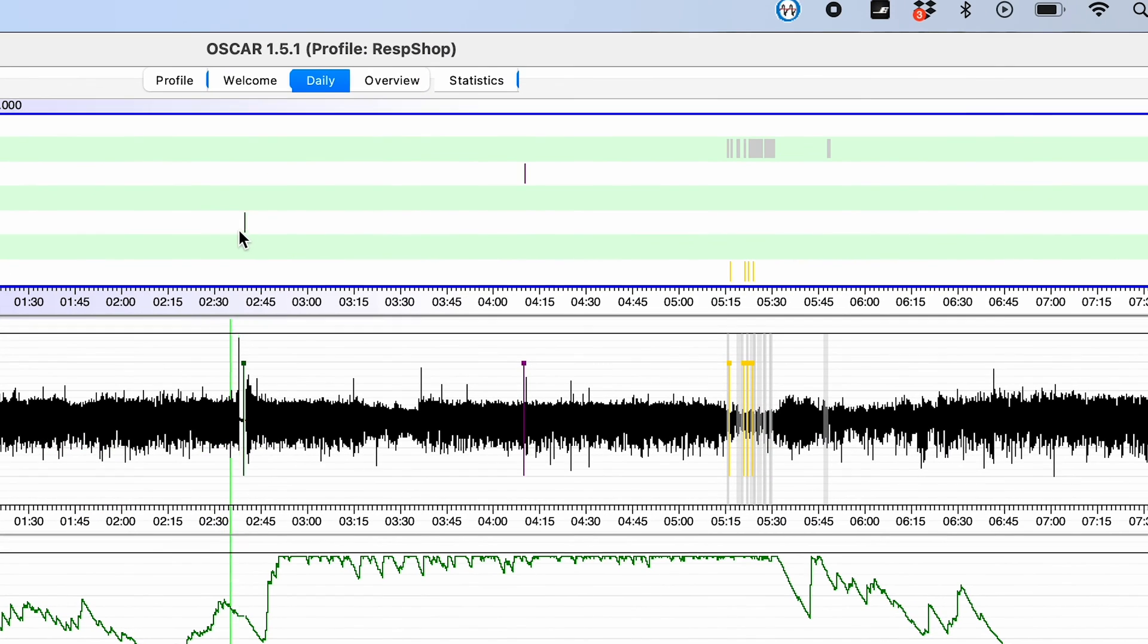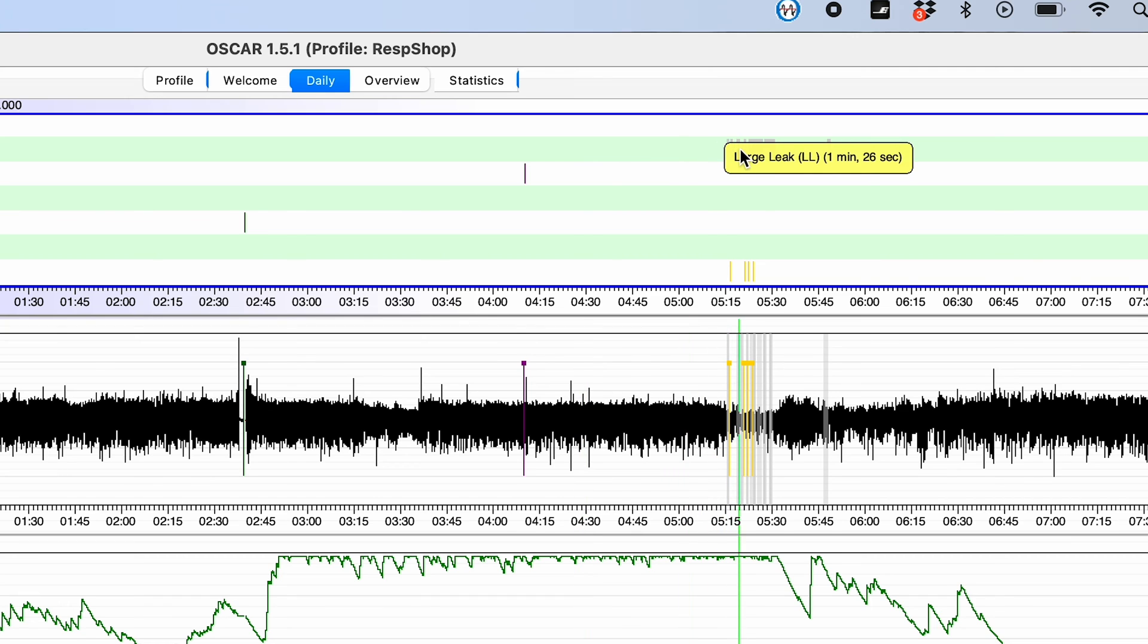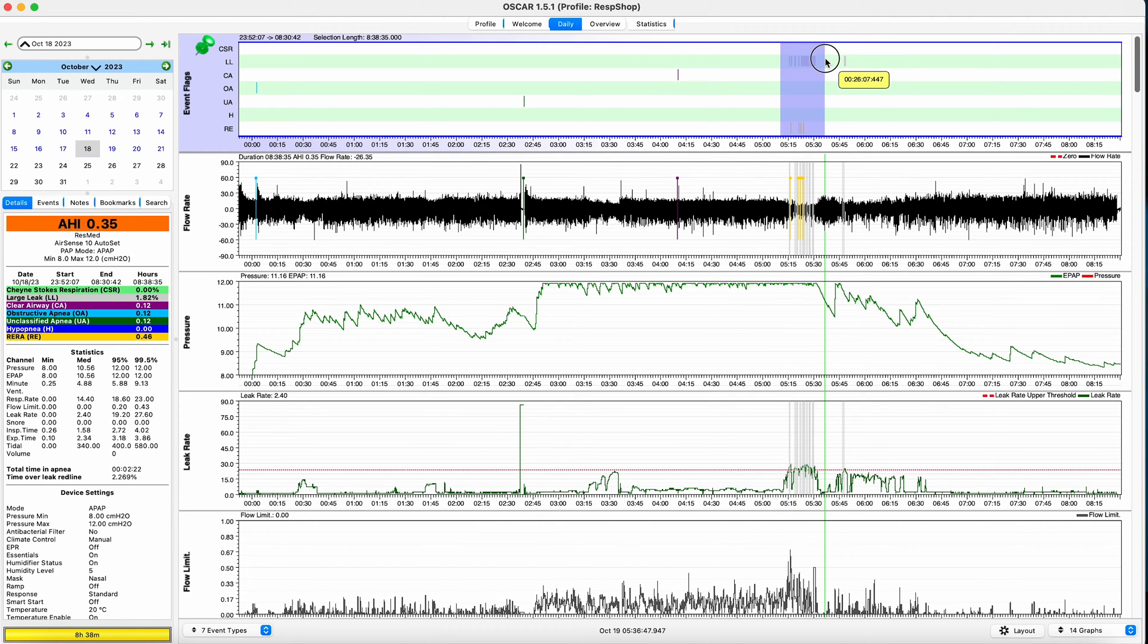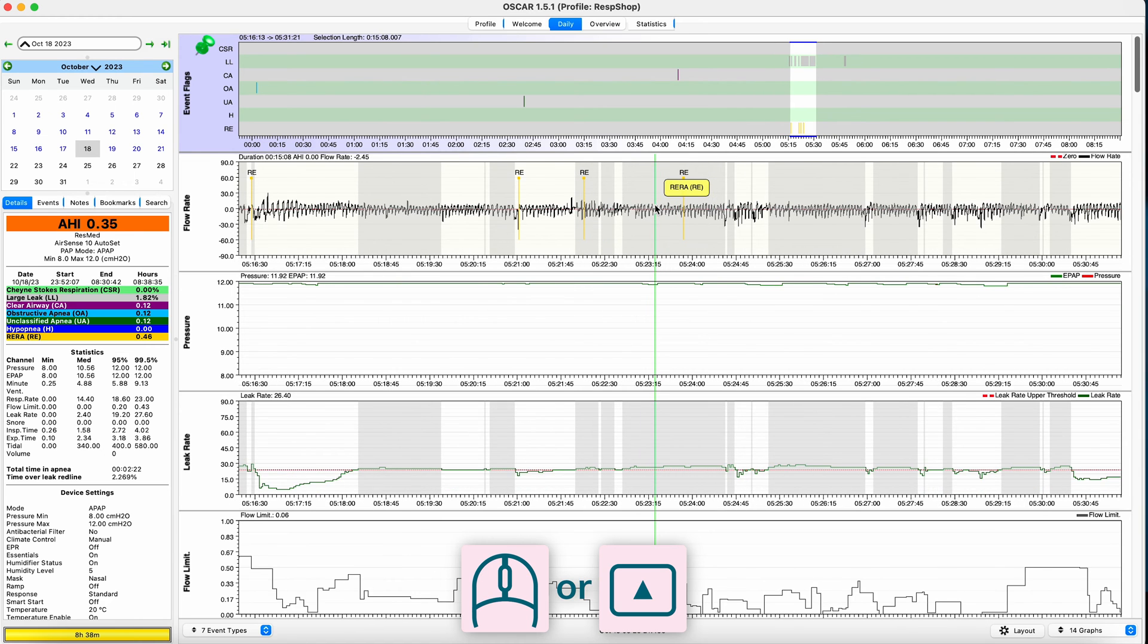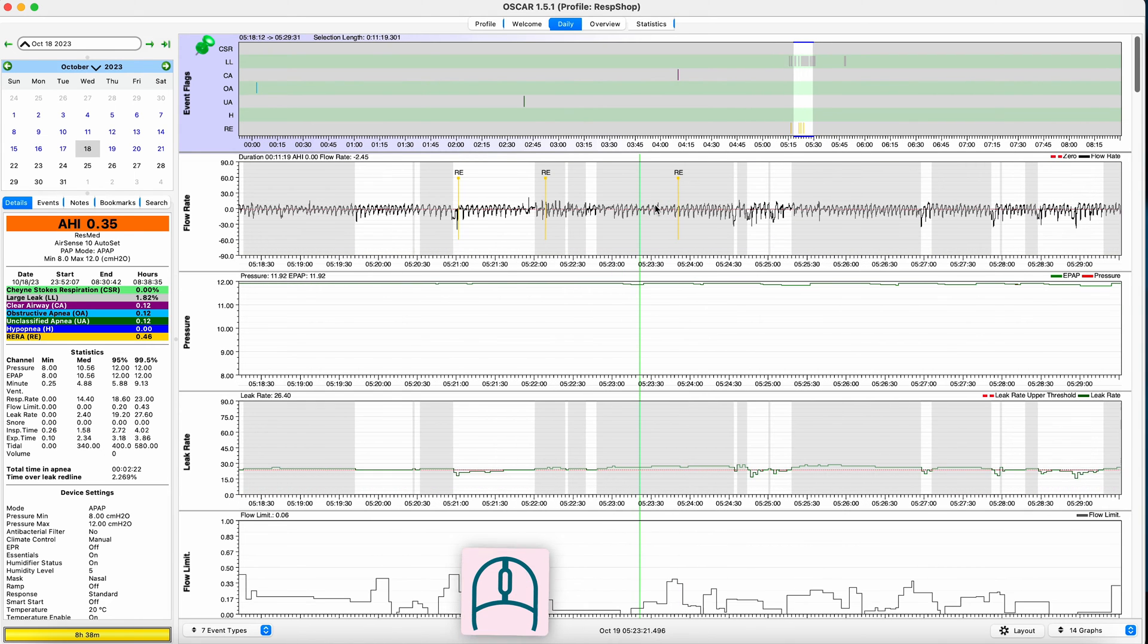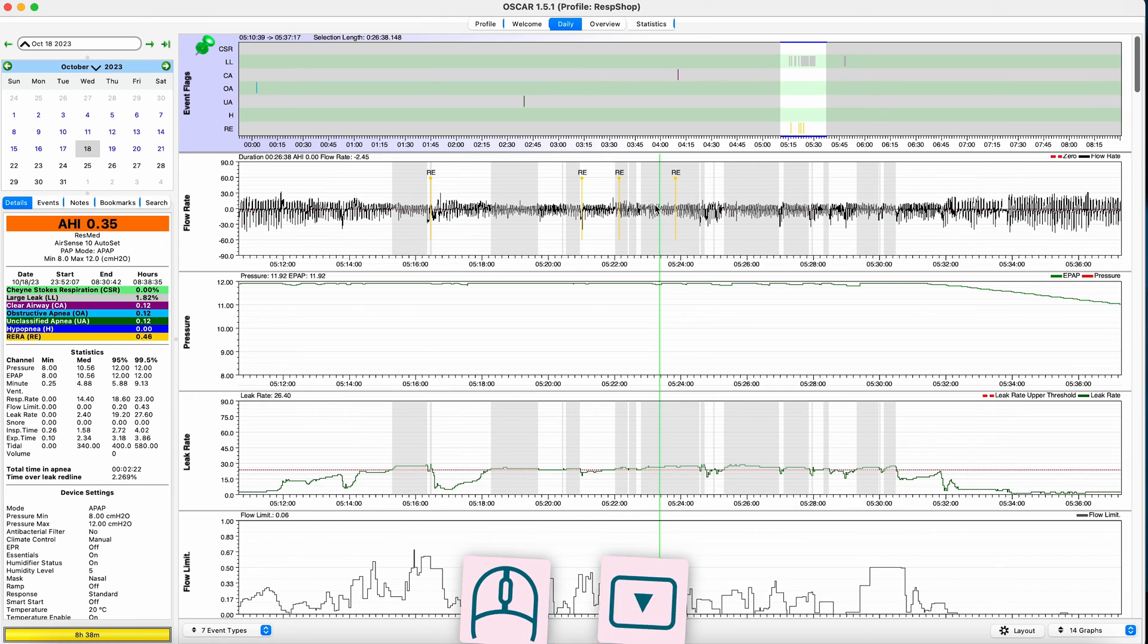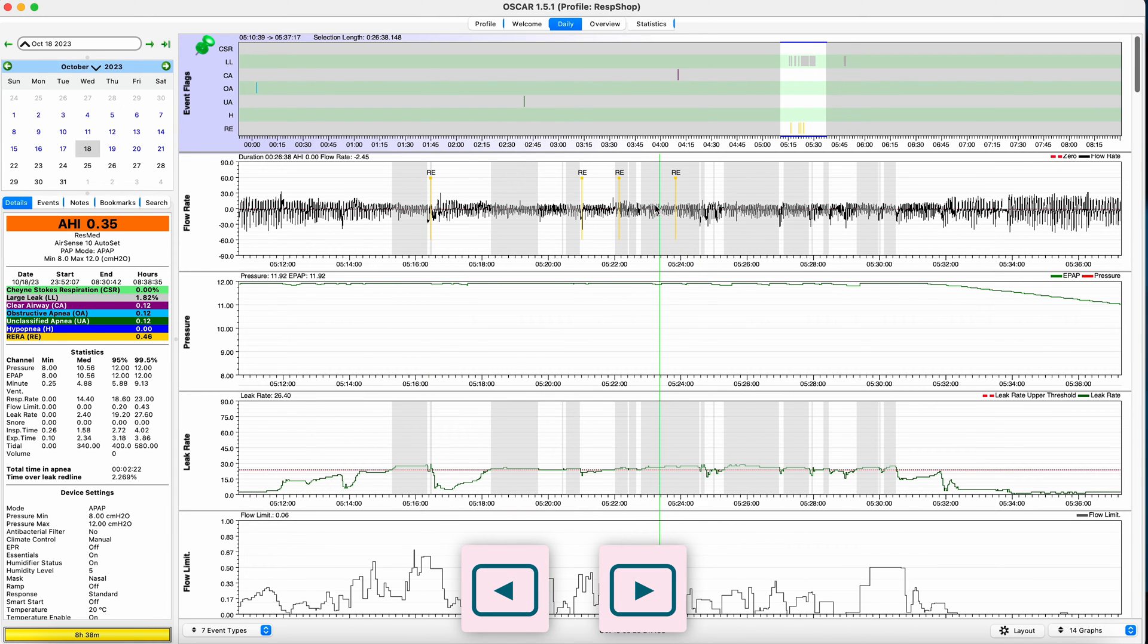And talking of events, the top track contains event flags to signal a time when there was an event. If you hover the cursor over any event, a small pop-up will list the type of event and its duration in seconds. The track also provides a very helpful way to focus on the data that you are most likely to be interested in. If you highlight an area of that track, the data in the charts below will focus on that time period. And if you left-click or push up, the time period will zoom in. And if you right-click or press down, it will zoom out. Right and left arrows will scroll left and right too.